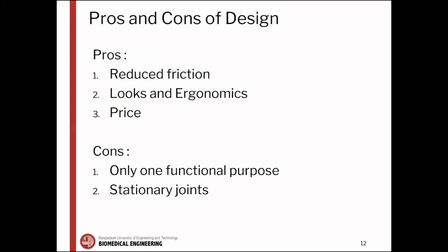We took reference from an available model as well as human hand, and the dimensions are also taken from regular human hand. So the prosthetic will look the closest to natural. We have also cut down expenses by excluding functionalities and also choosing low-cost materials.